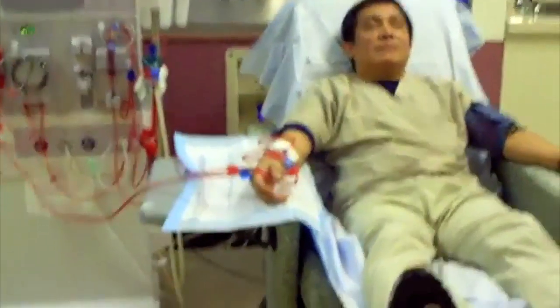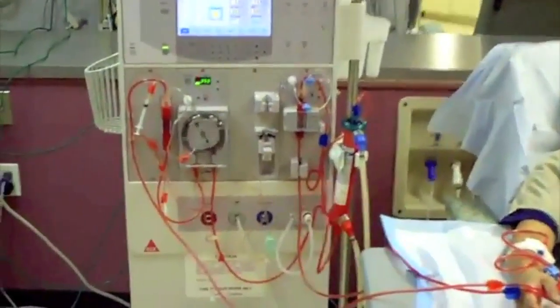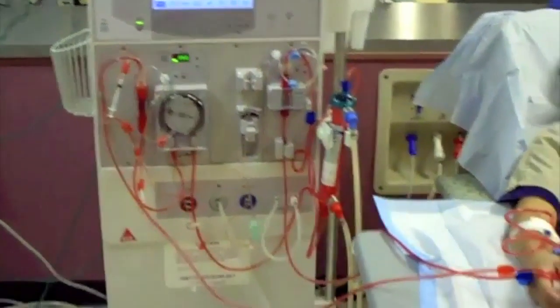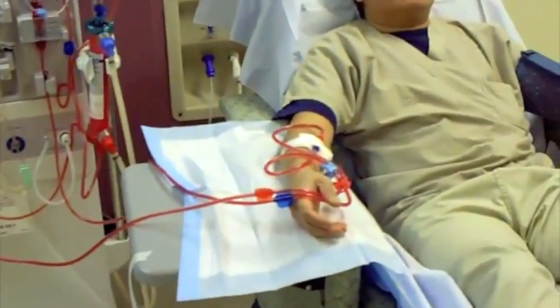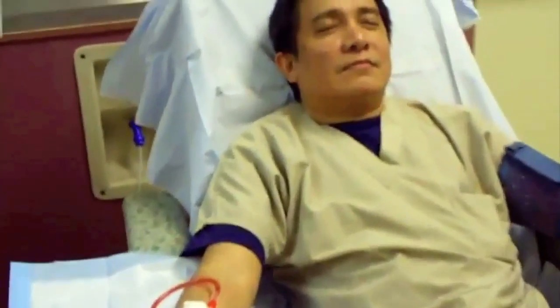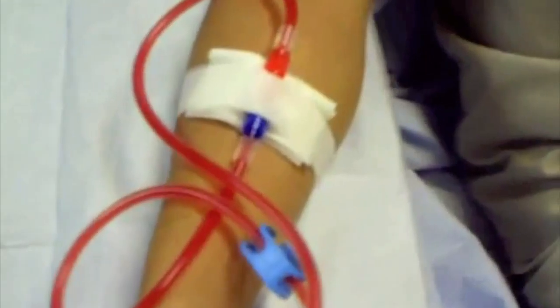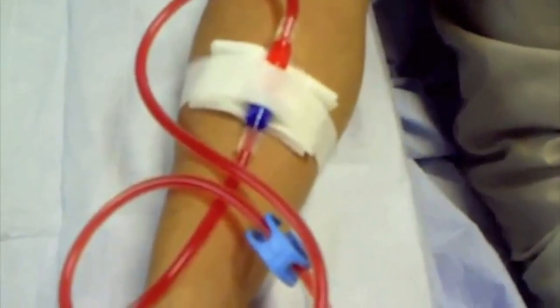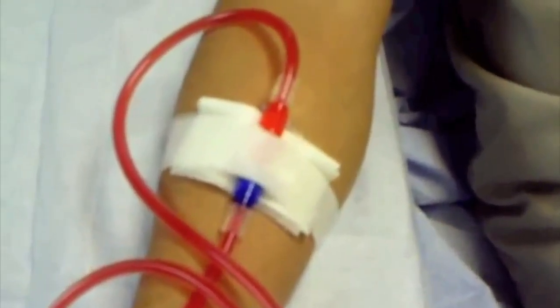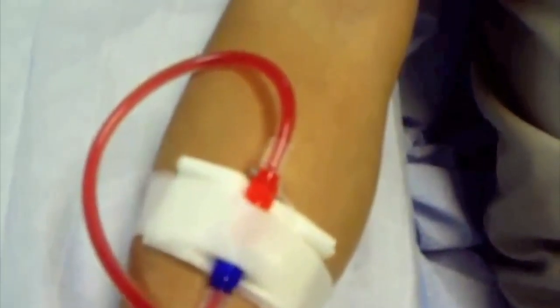Today, I will be speaking about hemodialysis and how it works like the human body. Hemodialysis is the most commonly used method for treating kidney failure. Before hemodialysis can be performed, a patient needs to have an access. For emergency cases, a catheter in the subclavian, jugular, or femoral is placed. But for patients who are already diagnosed ahead of time, they can have a fistula or a graft.